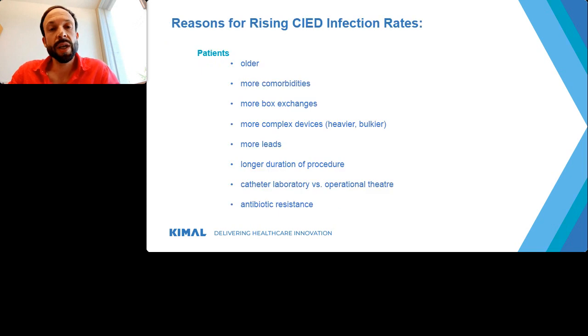What are the reasons for CIED infection rates? As we know, patients are older due to better work of us cardiologists or cardiothoracic surgeons, and therefore they display more comorbidities when they're undergoing CIED-related surgical procedures. Also, living longer with CIED means more box exchanges and more complex devices are used than just some years ago. They're in general heavier and bulkier and display more leads when implanted or handled.